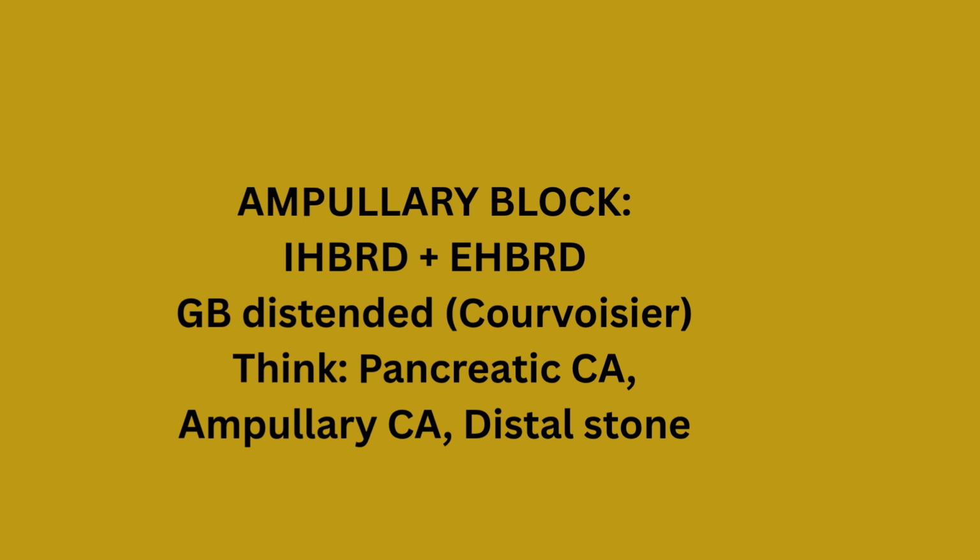And remember, fasting state is mandatory for gallbladder assessment. A fed patient with a contracted gallbladder gives you a false picture. For details, see Short 11.